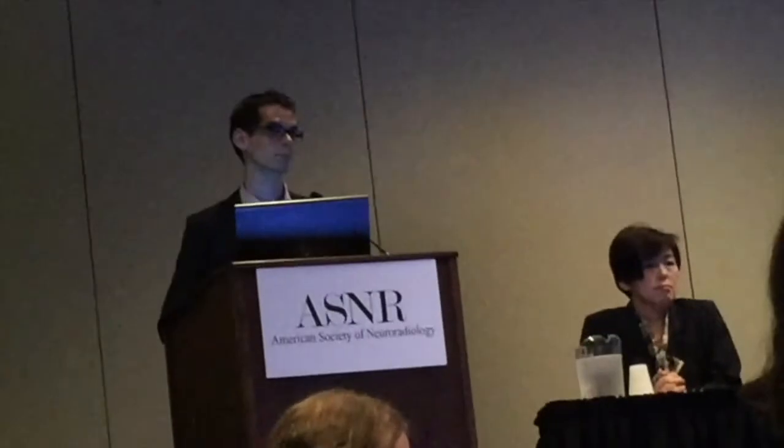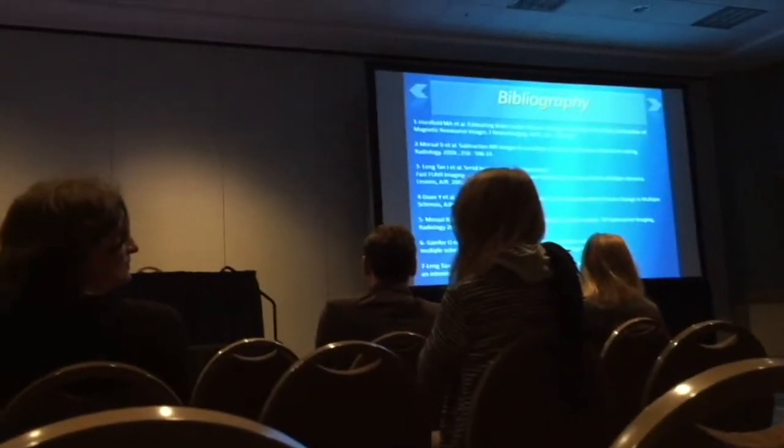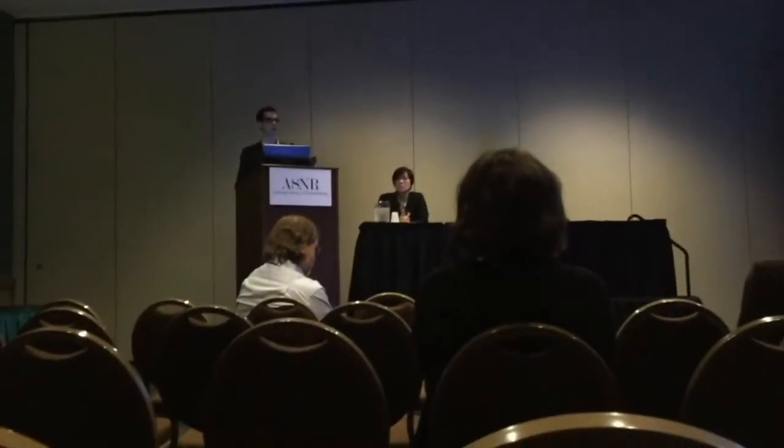Any questions from the audience? Can we quickly comment how you actually do it with syngo.via? Can you repeat? Can you quickly tell me how to do it, with syngo.via, I mean.